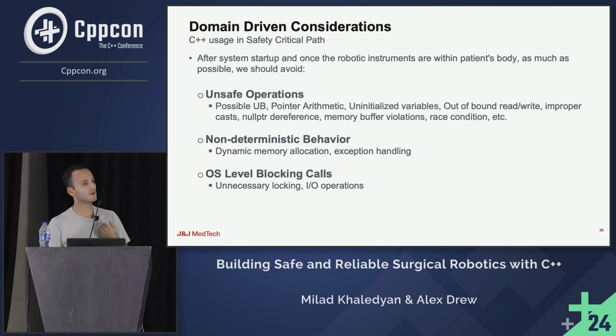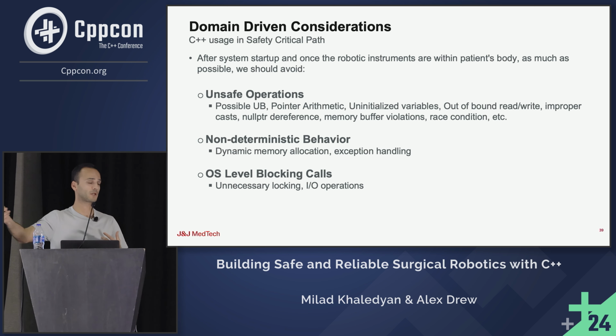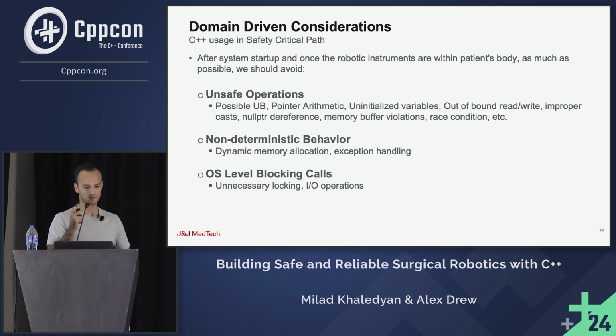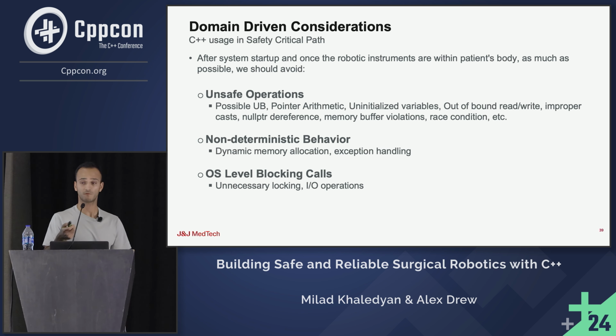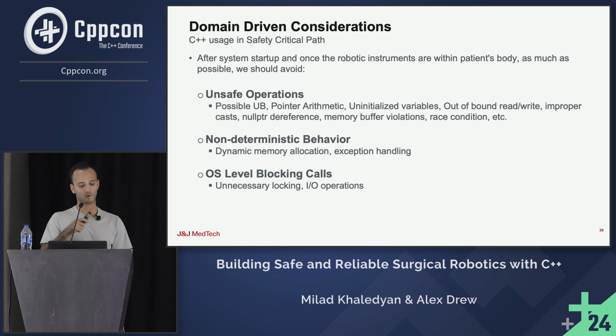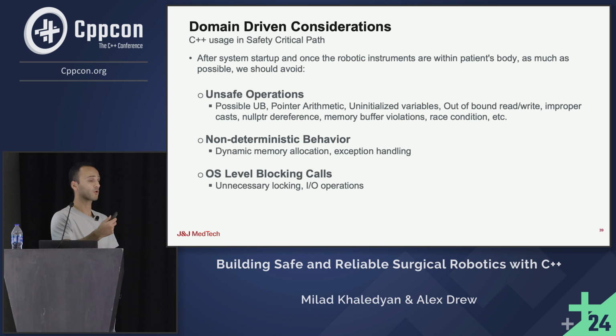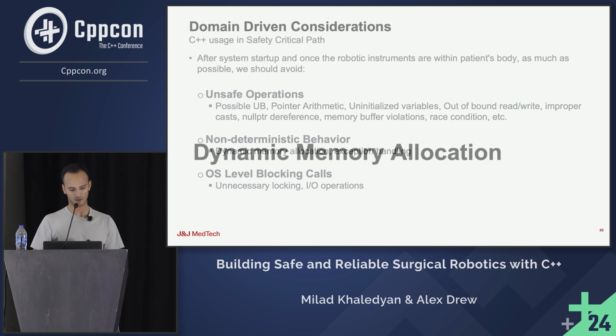And then we want to avoid non-deterministic behavior in the critical path, going from the surgeon console controlling the instruments essentially. So we want to avoid dynamic memory allocation. You've heard this probably a lot in these conferences and in the past conferences. Exceptions, we want to avoid exceptions. And then from an OS level we want to avoid blocking calls, unnecessary locking, IO operation. We want to stick to async programming and primitives within STL.